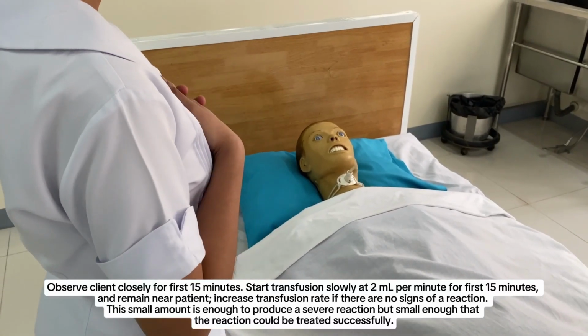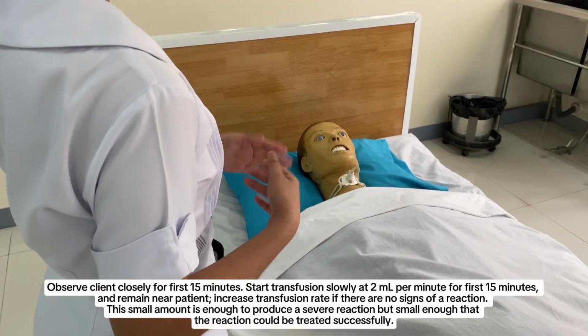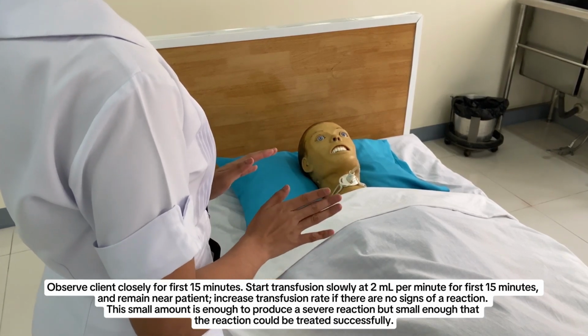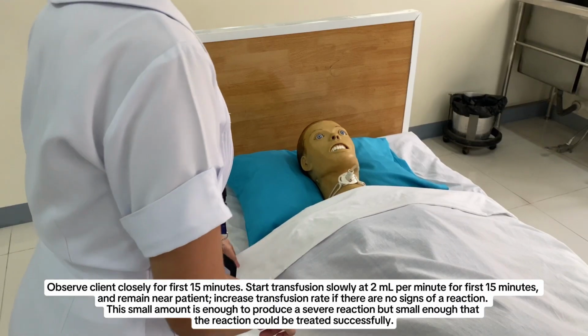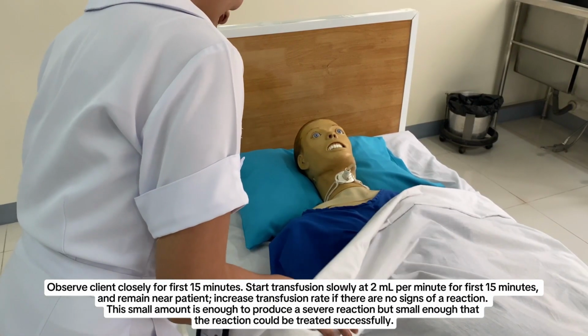Observe client closely for first 15 minutes. Start transfusion slowly at 2 milliliters per minute for first 15 minutes, and remain near patient. Increase transfusion rate if there are no signs of a reaction. This small amount is enough to produce a severe reaction, but small enough that the reaction could be treated successfully.